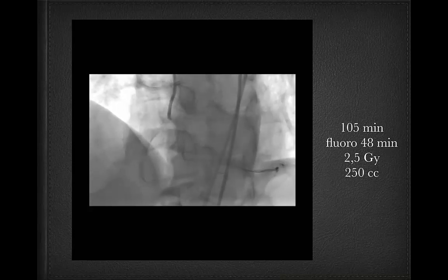Beautiful, this RCA. Beautiful, and I guess it's an example here where trying antegrade first, although it didn't look very favorable with all the calcium, by doing the escalation, you actually got a very nice result without having to go retrograde or do other more complicated techniques. So that's a great example. Is that your typical go-to when you have an antegrade channel, a puncture with a Pro 12 and then downgrade to a softer wire like the Fielder XT that you did in this case?